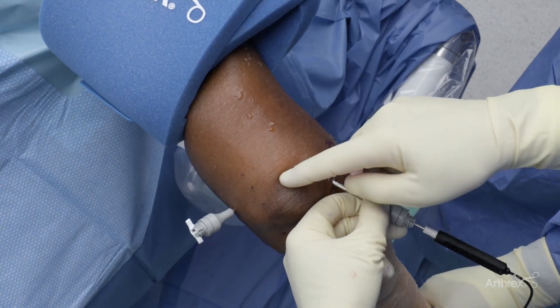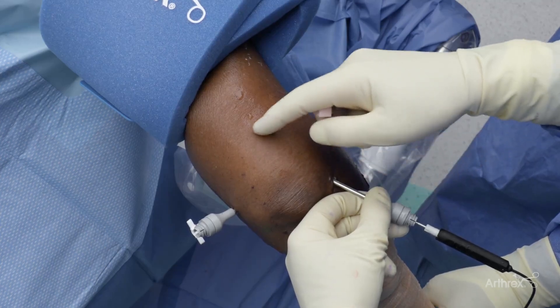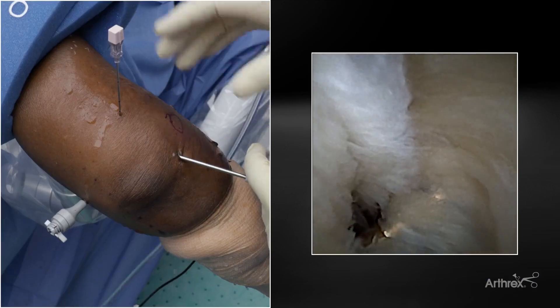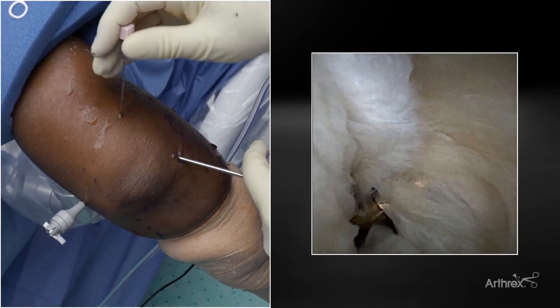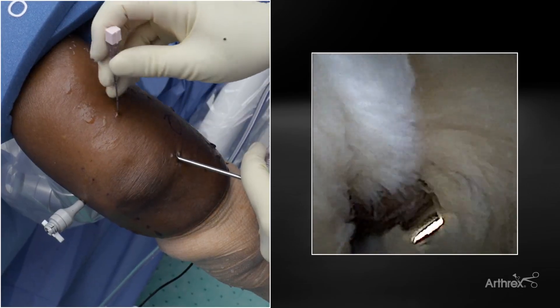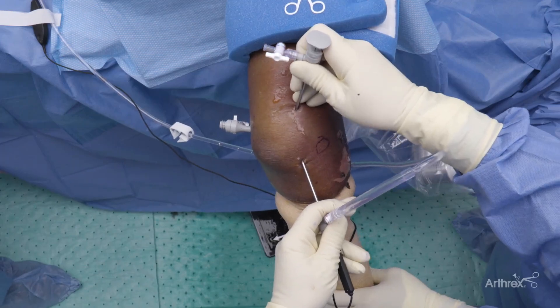Now we're in the olecranon fossa, and what we're going to do is make a posterior portal. One of the little tips is you want to go a little bit farther back than you would expect. This is the tip of the olecranon, and you actually want to go two or three centimeters more posterior to get into that space. As we get to the posterior compartment — the olecranon fossa region — we just take our needle. We want to be two or three centimeters proximal to the olecranon tip. It's a little bit more of an angle than you would normally expect. Here's our posterior portal with our trocar.